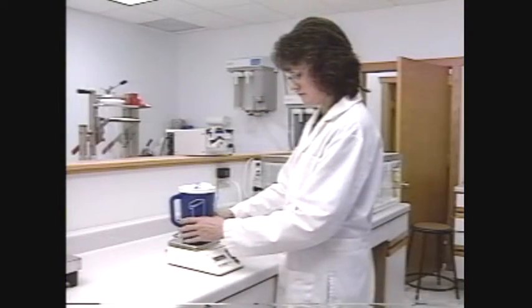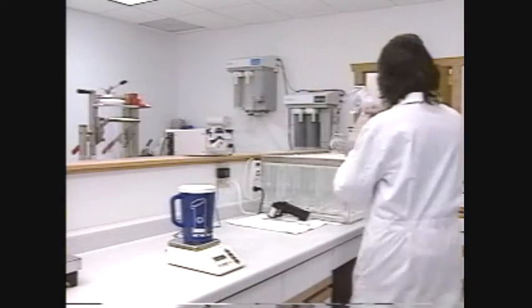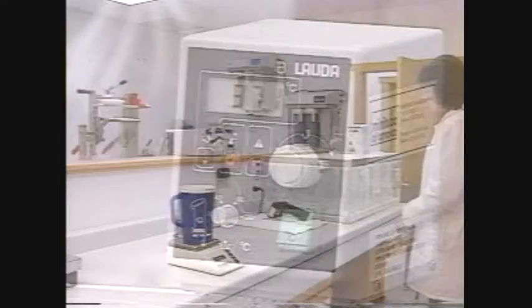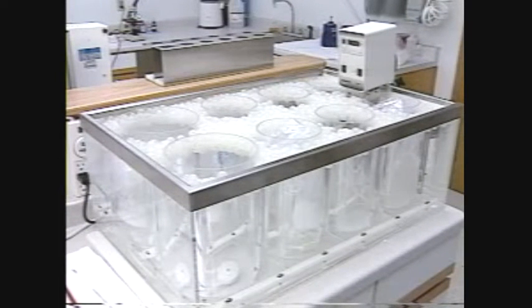As an alternative procedure, after placing the collection cup, collection bag, and semen on a scale and taring to zero, the collection bag with semen can be quickly transferred to one of the cylinders of a mini-tube water bath. The water bath should be maintained at approximately 37 degrees Celsius, 98 degrees Fahrenheit, since within the plastic cylinders, temperatures will be maintained approximately 1 to 2 degrees Celsius lower.